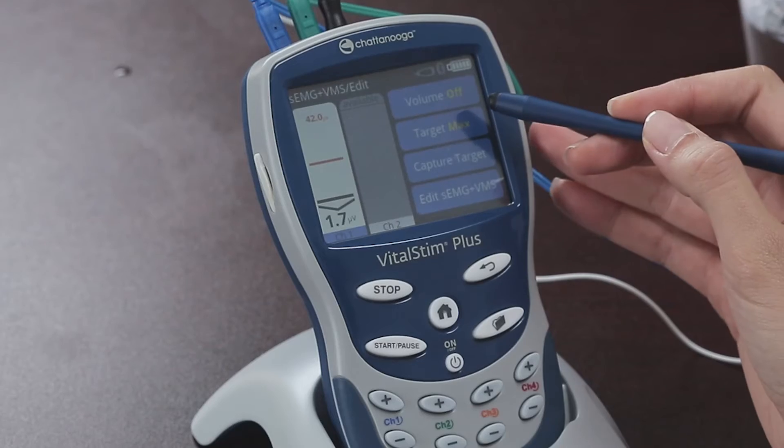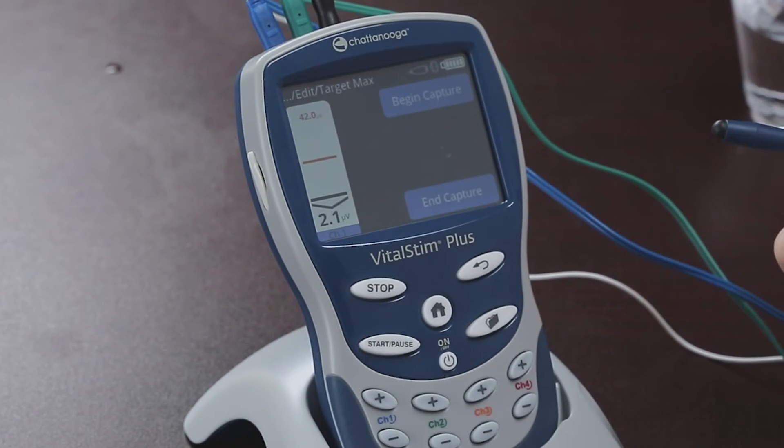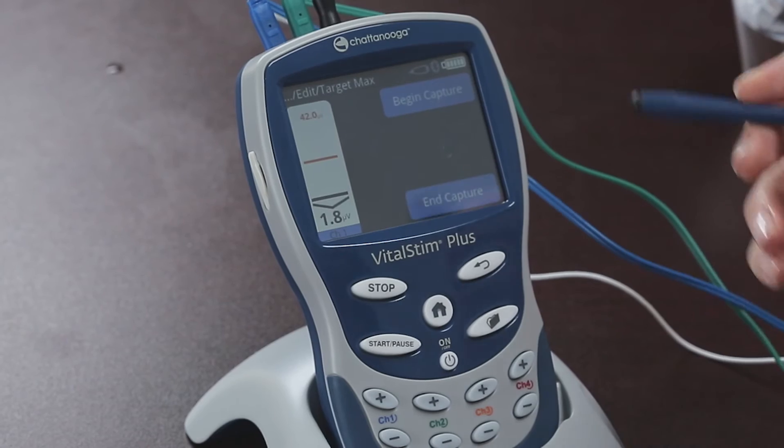Next, we must capture the target level like we did before. Press capture max and perform the same sequence as in surface EMG biofeedback.